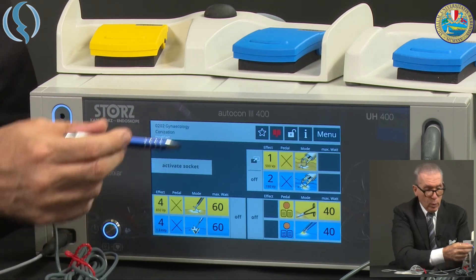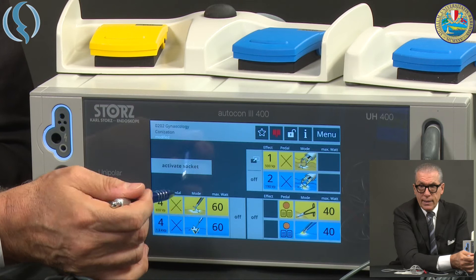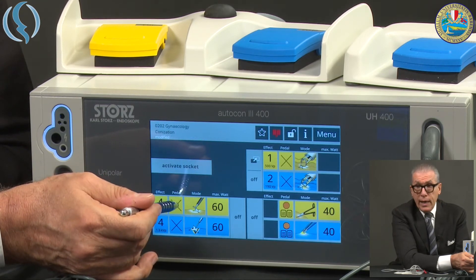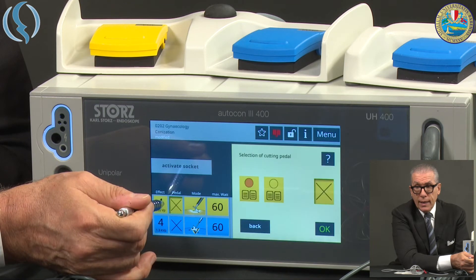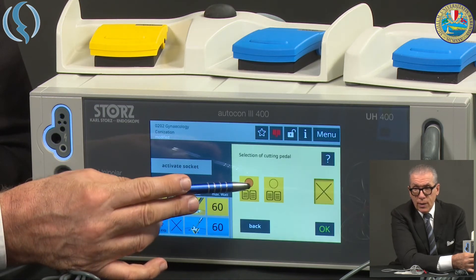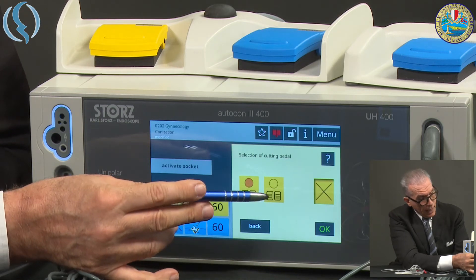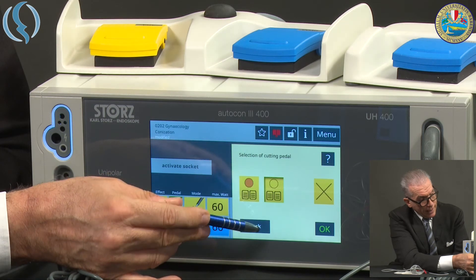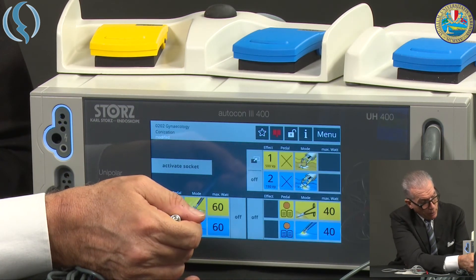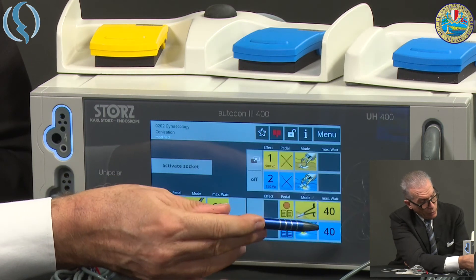Let's go to the monopolar mode. There are already two options — let's say these two options are good for me. Now I have to choose which activation I need. Having already assigned the highlighted button for the bipolar, I will choose the non-highlighted one for the monopolar, for both cut and coagulation.